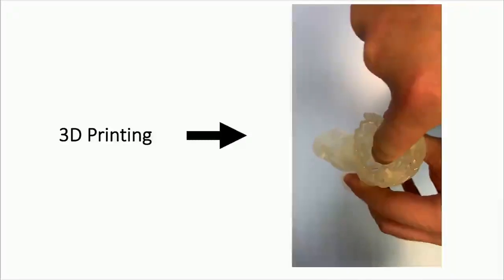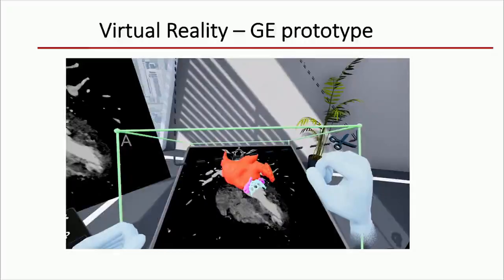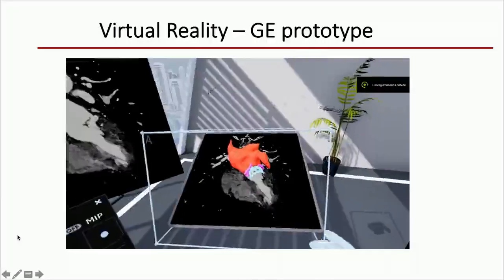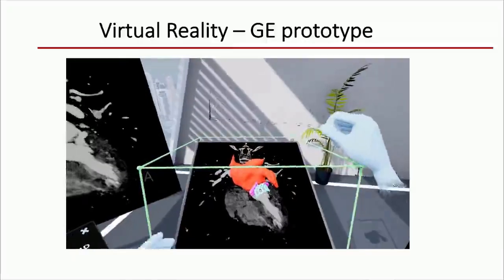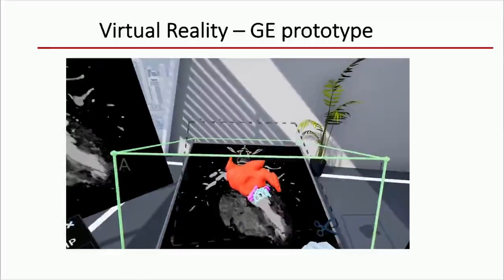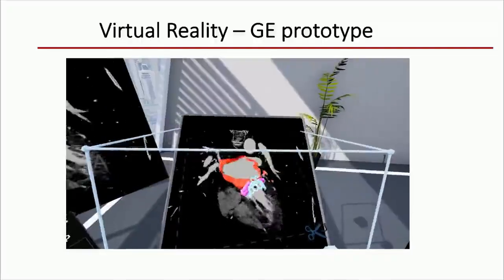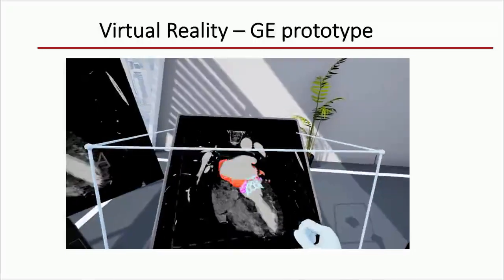Now, some of the more state-of-the-art technology that we have in the pipeline in development with GE is also the availability of virtual reality. And the principles behind the virtual reality and all of the imaging techniques that you've seen is to make the imaging expertise available for use by the interventional cardiologist who is performing the procedure.